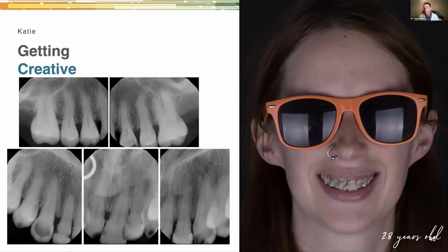Yeah, I think for us it's anywhere from a 90-minute to a 2-hour appointment. Really efficient though, because like you said, there are periods of time where if you know how to schedule those visits, you can schedule other production during the time when it's being milled and during the time when it's in the oven. It does take a little bit of an adjustment if you go from doing a 2-step crown process where you're sending it to a lab to doing single visit, which is training your team to make sure that one, they schedule properly to maximize your production, and two, the workflow goes smoothly.